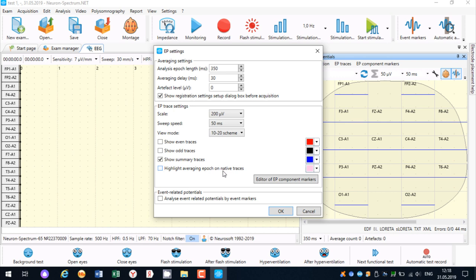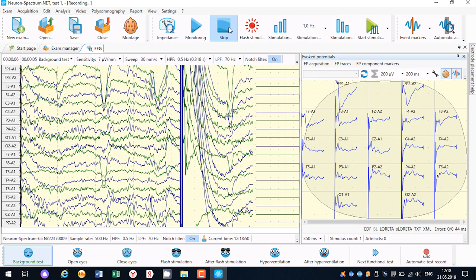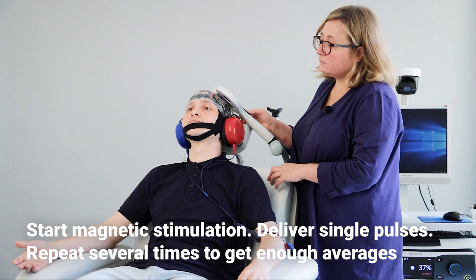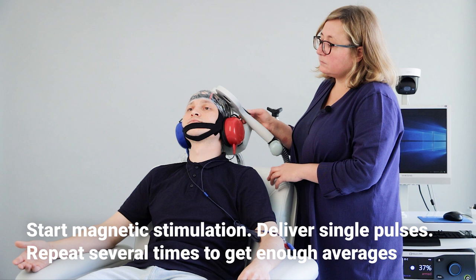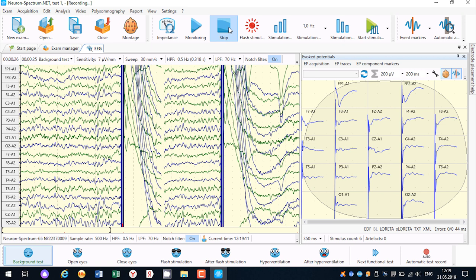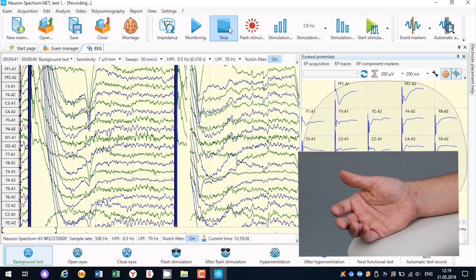Change the scale in EP trace settings to 200 µV and change the sweep speed to 200 ms. Press the record button on the toolbar, then start magnetic stimulation and deliver single pulses. Make different pauses between pulses from 2 to 5 seconds. Repeat several times to get enough averages. Typically, 10 to 80 stimuli are required to get good responses.